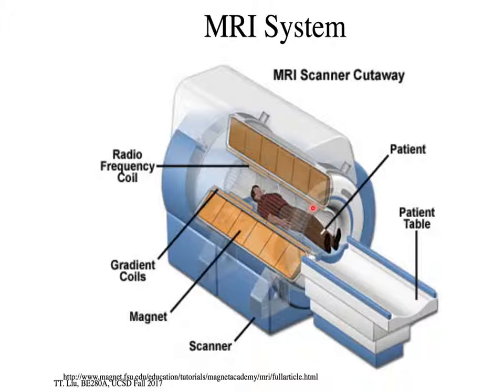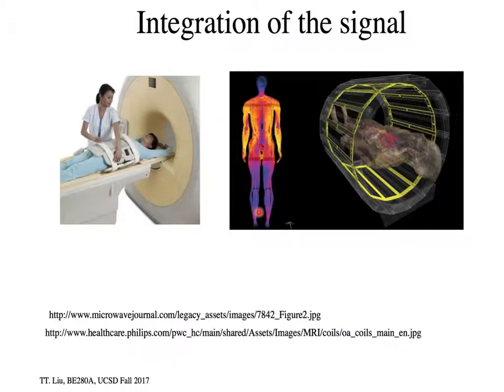That's a gradient coil. And then inside that is a radio frequency coil, which is used to transmit radio frequency energy into the patient and then receive radio frequency energy from the patient when you've stimulated a signal. This is called a body coil, and this is principally used for transmission, and it would transmit energy into the entire torso of the patient. And then this is the receiver coil that will be switched on to receive the signal once the patient starts emitting radio frequency energy.